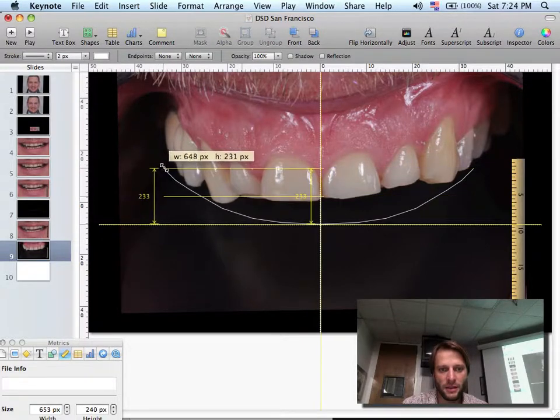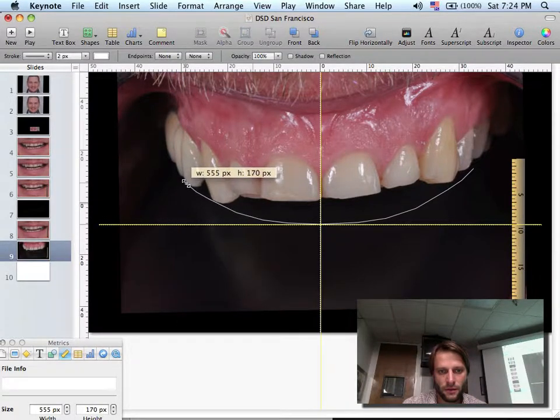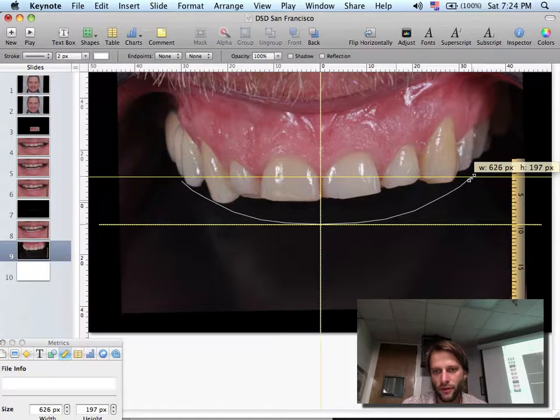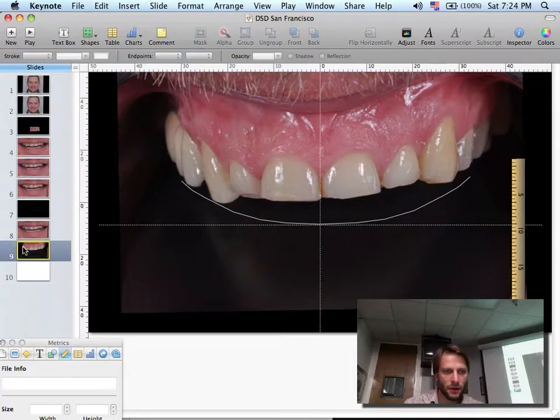Clicking on the end here and dragging it to the point that I want. Same thing over here. It doesn't need to be perfect, just similar. So that's my curve. I save and I duplicate, or I duplicate and I save.